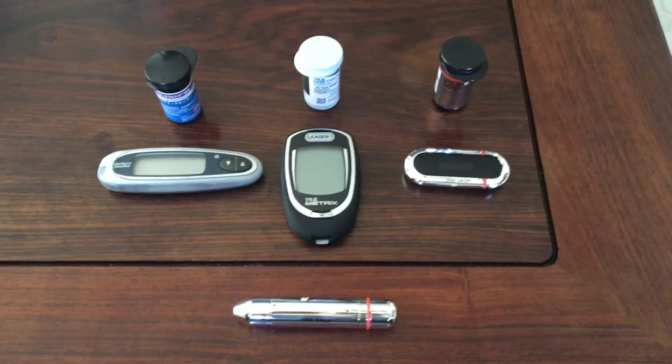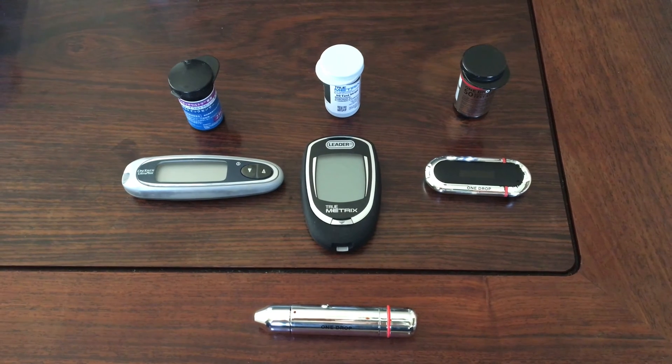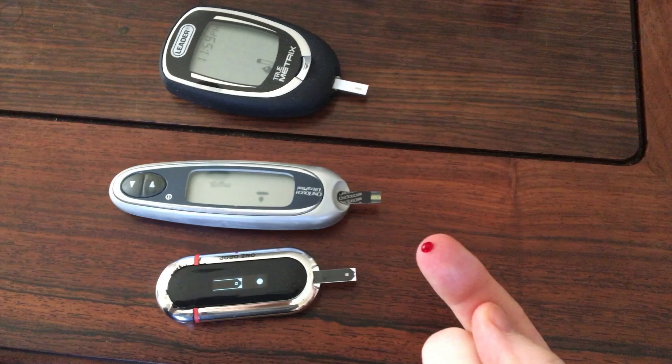In my travels around the world over the years, I've accumulated three different blood sugar meters. So I decided to test them all at the same time with the same drop of blood to see how close they were to each other.